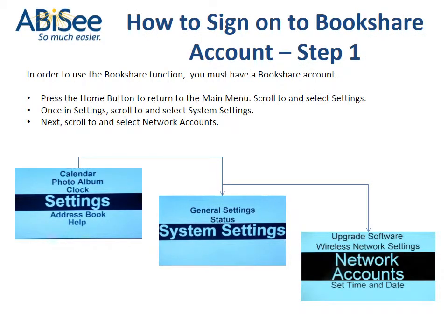How to sign on to Bookshare account. Step 1. In order to use the Bookshare function, you must have a Bookshare account. Press the Home button to return to the main menu. Scroll to and select Settings. Once in Settings, scroll to and select System Settings. Next, scroll to and select Network Accounts.